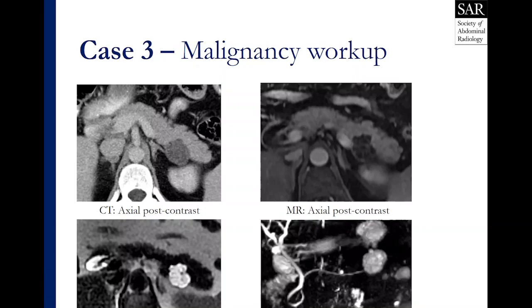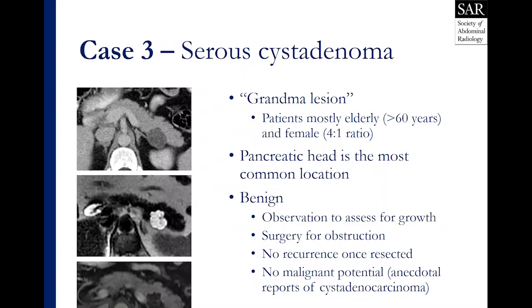Here's case 3 — a patient for a malignancy workup. CT and MRI axial post-contrast images show a focal lesion in the posterior distal pancreatic body and tail, with axial T2-weighted images and a coronal MRCP also shown. This is an example of a serous cystadenoma. For those who have heard the term grandmother-mother-daughter lesion, this is the classic grandmother lesion — named so because most patients are elderly, over 60 years old, and most are female at about a 4 to 1 ratio. The pancreatic head is the most common location, even though this example shows a serous cystadenoma in the pancreatic tail.